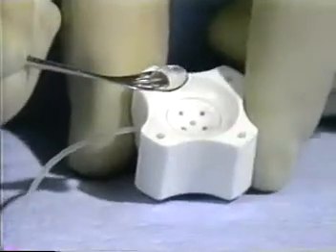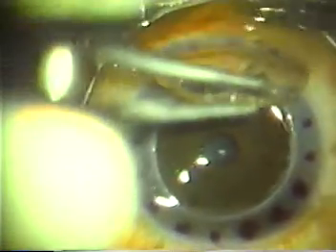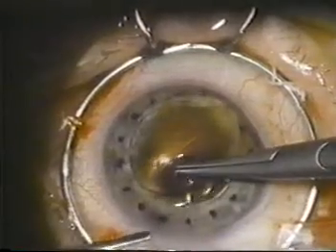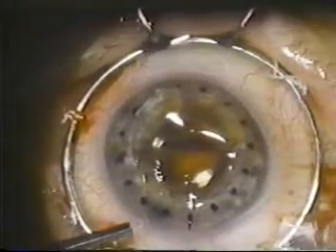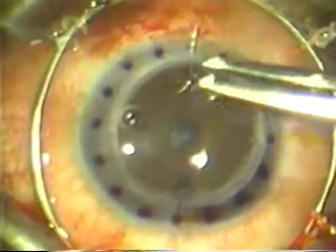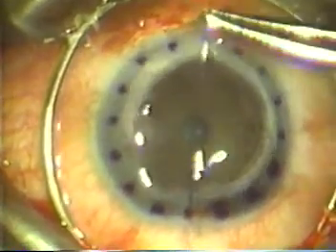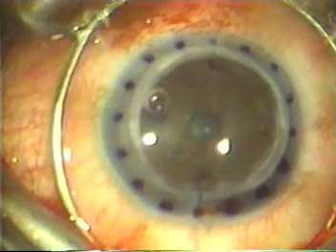The donor corneal button is removed from the well of the cutting block and held with forceps at one of the four circular marks and positioned on the eye. A suture is placed in the donor cornea at the center of the circular mark and in the recipient cornea at one of the 16 radial marks. After the first suture has been tied, the second suture is placed in the donor cornea at the center of the circular mark 180 degrees away and in the recipient cornea at the radial mark 180 degrees away. This ensures even distribution of the donor cornea in the recipient bed.